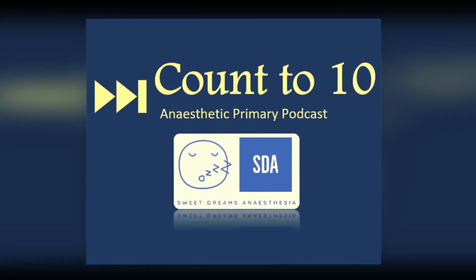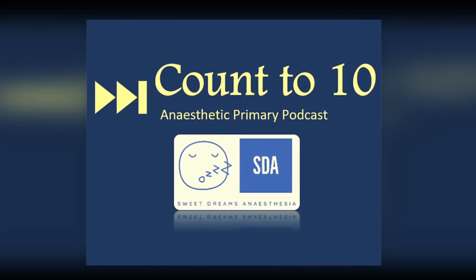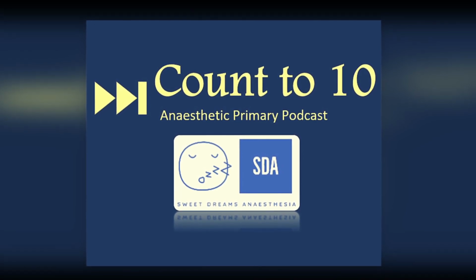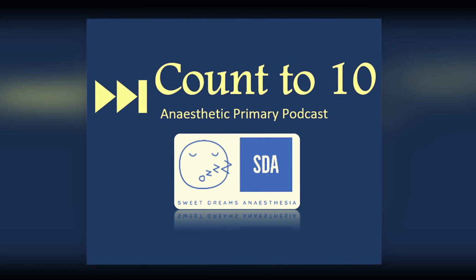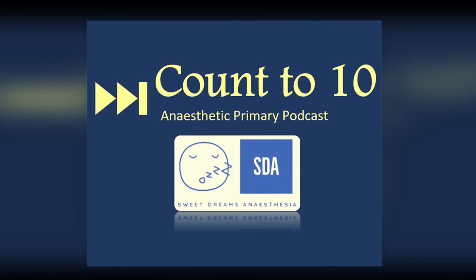The only other question they can ask with regards to the pulse oximeter was from 2019, which was explain the reasons why a pulse oximeter may give an incorrect reading. Again, this had a low pass rate of 33%, and the common problems included vague statements like causes inaccurate reading, without precise statements of causes of false low reading, given very detailed description of how the pulse oximeter works, but failing to link this to how an error is created, lack of detail or confusion about the mechanism by which the errors are caused, and then again using the terms SaO2 rather than SpO2.